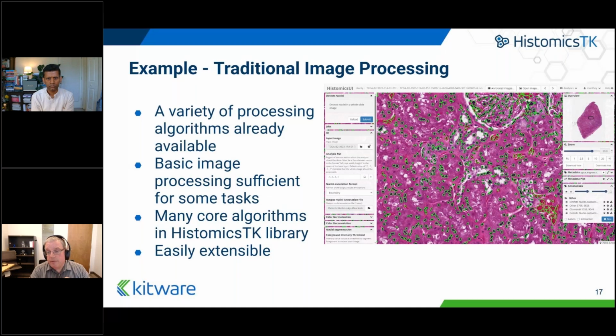And then you can say, okay, I'm going to find this using blobs and say, okay, all these little blobs are my nuclei. And anyone who knows biology can see that there are a few that have been missed. You can also see there are some areas that probably are some sort of blood vessels or something that probably aren't nuclei. So this shows both the power and limitations of traditional image processing.